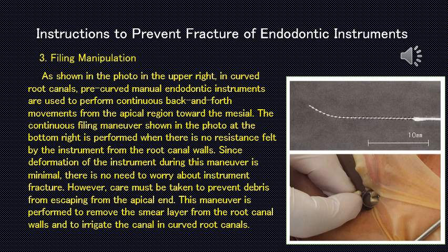Since deformation of the instrument during this maneuver is minimal, there is no need to worry about instrument fracture. However, care must be taken to prevent debris from escaping from the apical end. This maneuver is performed to remove the smear layer from the root canal walls and to irrigate the canal in curved root canals.